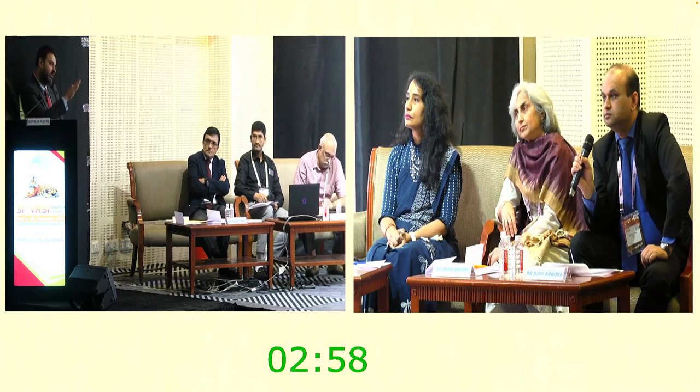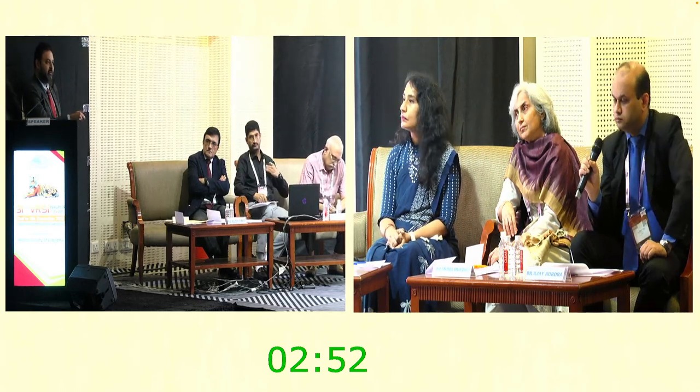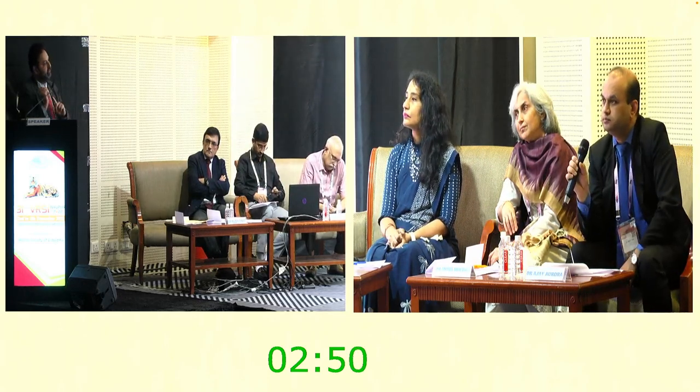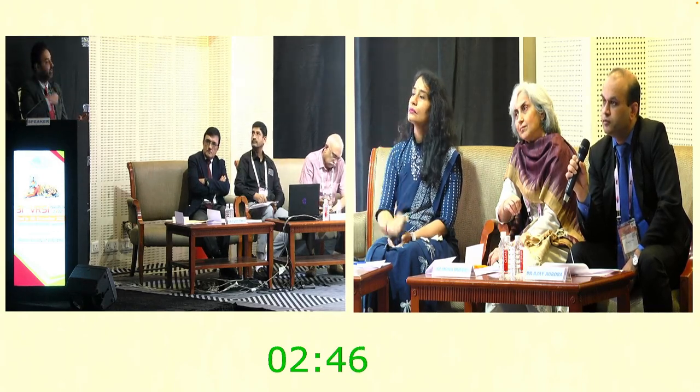We're trying to now settle the retina. Now, if we were to try and think that we use a 41 gauge cannula, and we try and do FAX, and we try and get all of that out, we'll be there till evening, because it's not happening. And mind you, that is with the suction of the machine. This is not with the suction of the machine.